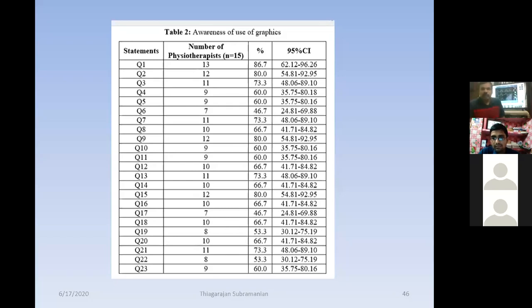Mode is based on continuous ventilation, then synchronized intermittent mandatory ventilation, and then spontaneous mode. Like that, slowly, once the lung is recovering, we can alter the mode of ventilation. If you specify a case study, I can say which ventilation can be used. The question you have asked is a general question, so I am just giving this; I think it may satisfy your answer.